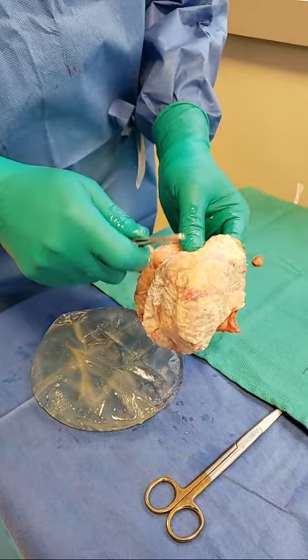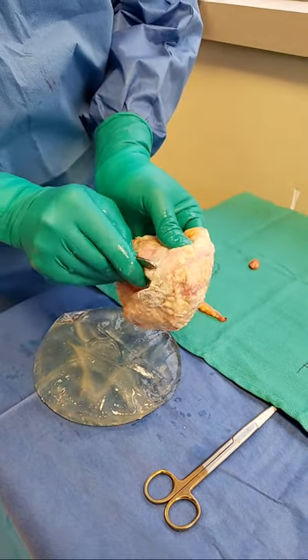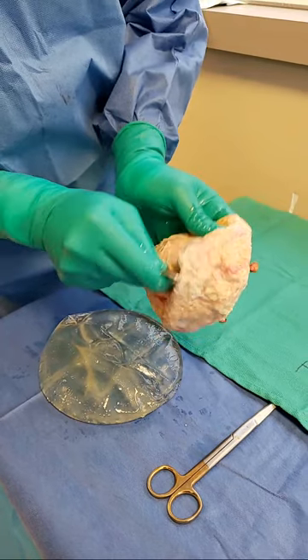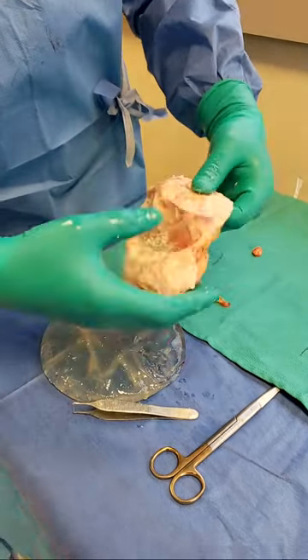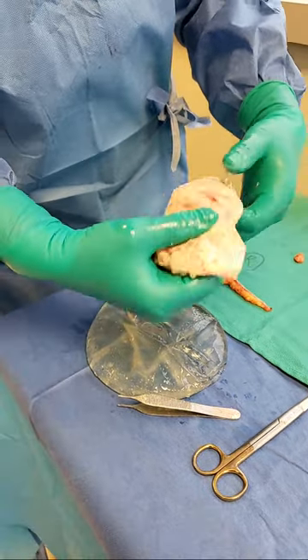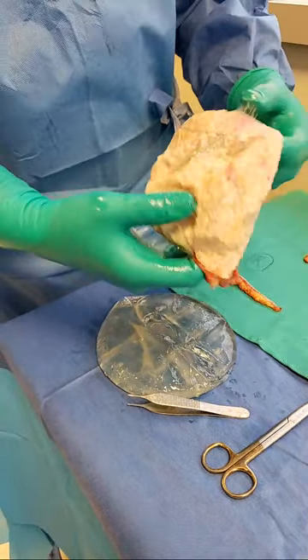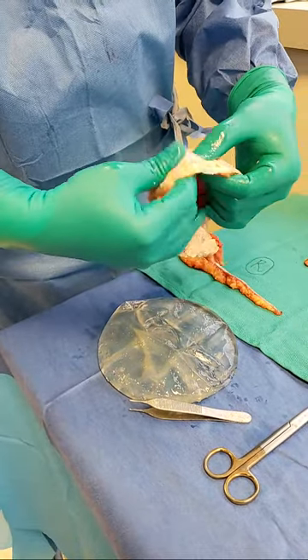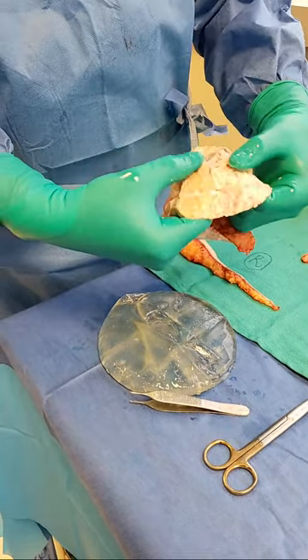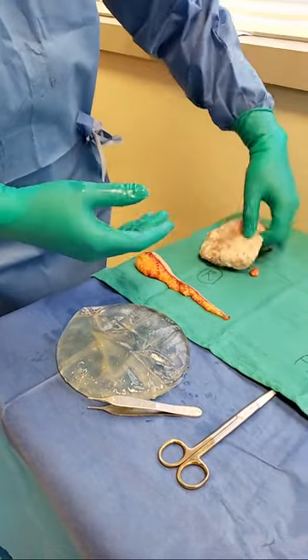This is a different consistency — there's a brown tinge to it, and this I can actually scrape off. Some of this is relatively thick, some relatively thin, and again, very abnormal. This is not healthy tissue. This is all reactive. The body in itself is trying to contain this. Look at the pain and misery that this patient has gone through.